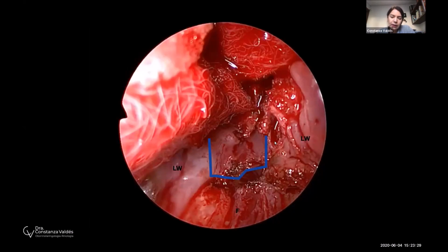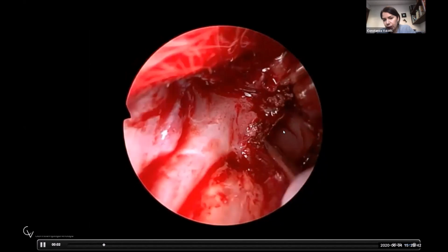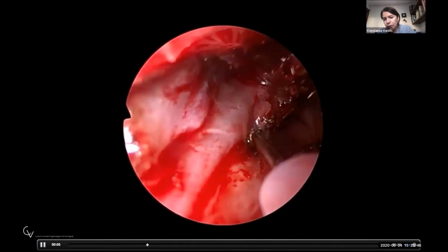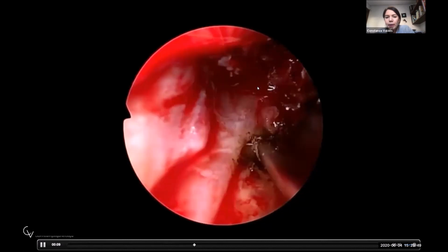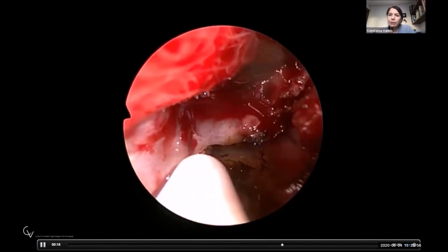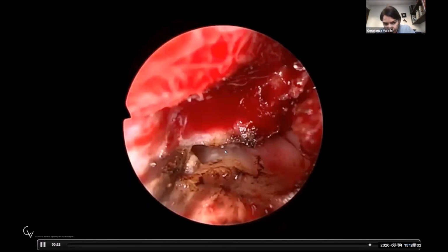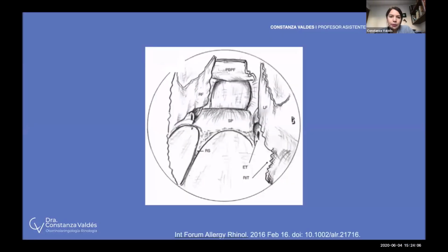So here's the nose, the lateral wall, the floor, and here's how we draw the posterior flap. And in live surgery, now here we have the new choana, and we are cutting with a needle cautery so we can flip it. There are some relaxation incisions that we make over here and over here when we finish, so it flips over and doesn't come back into the nose. And we can see now how the choana is there, and this flap will go up the nose. So finally, at the end of the surgery, we're going to have 3 flaps, 2 over the lateral wall of the nose, and 1 over the body of the sphenoid.